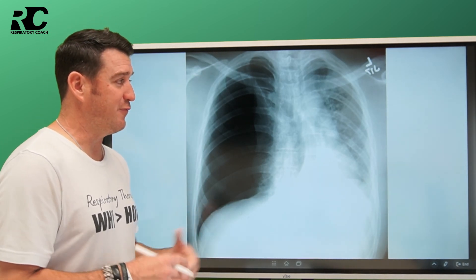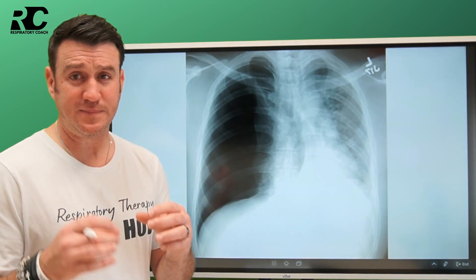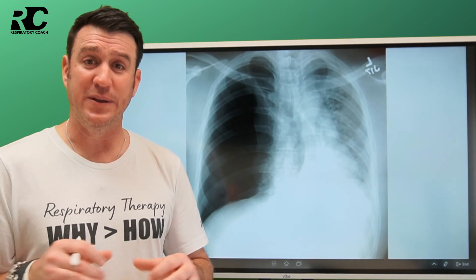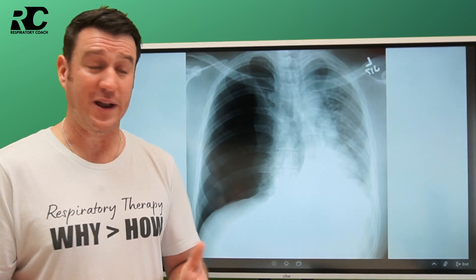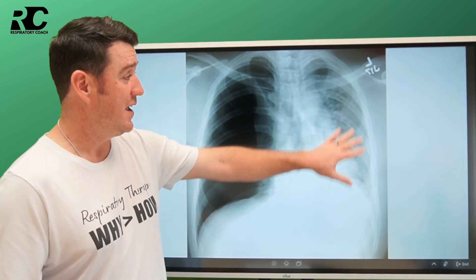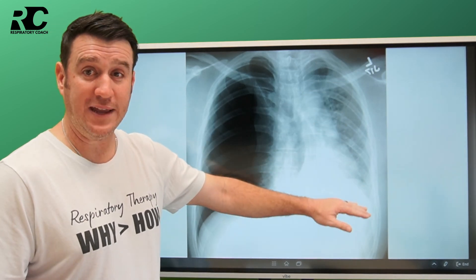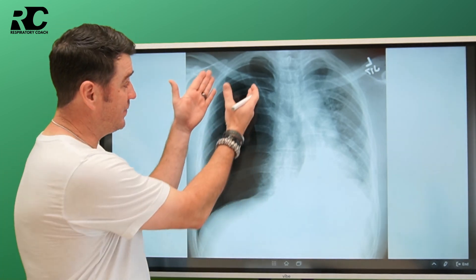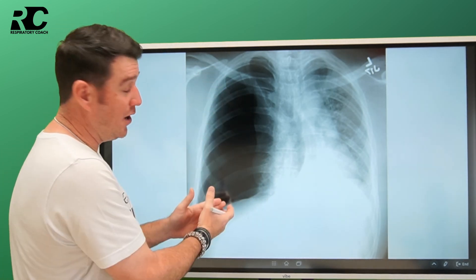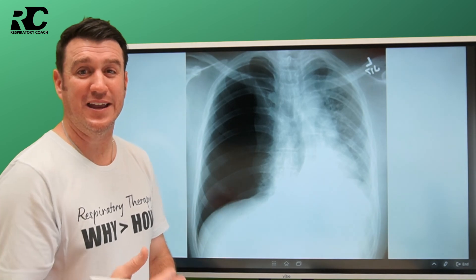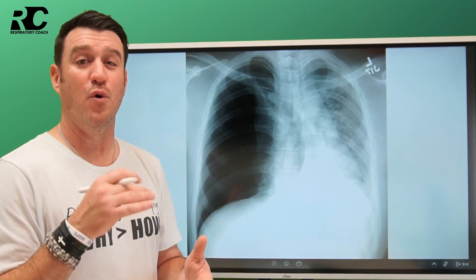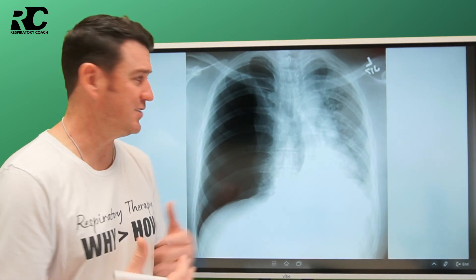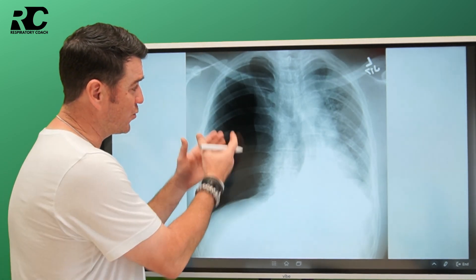When we look at this x-ray, the first thing I notice is that I can see two lung fields, but they don't look the same. On this side, I see more white, more haziness, more opaqueness. On the other side, I find more blackness, more hyperlucency. I noticed that right off the bat.